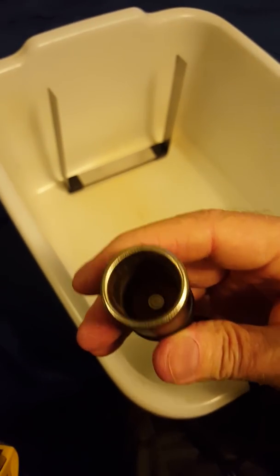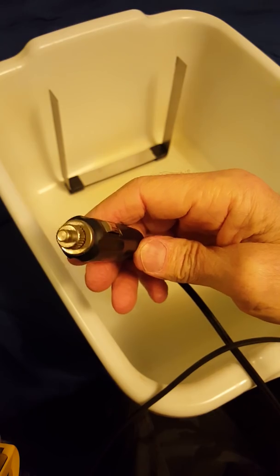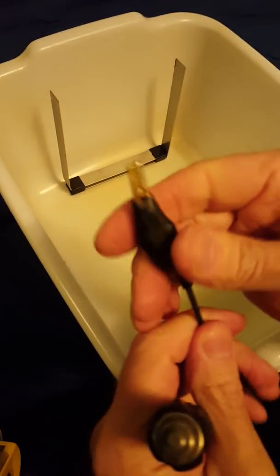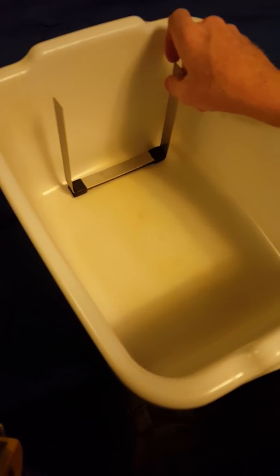The other problem with this device is that it comes with a cigarette lighter plug at the end of it. So then you've got to make yourself clamps. What I did for her was I got this cigarette lighter extender, and at the other end of it, I cut the other end off and replaced it with clamps. So that's how the current gets to those. Yeah, we've had great benefit from it.